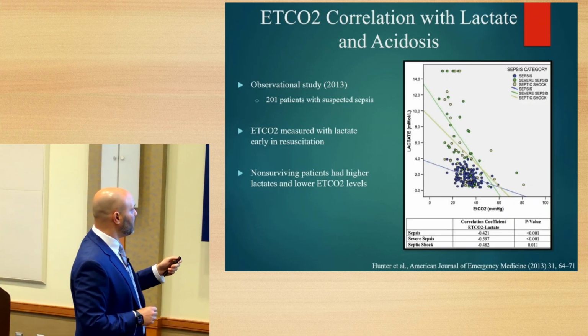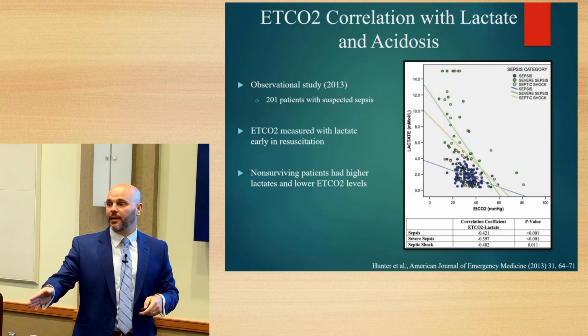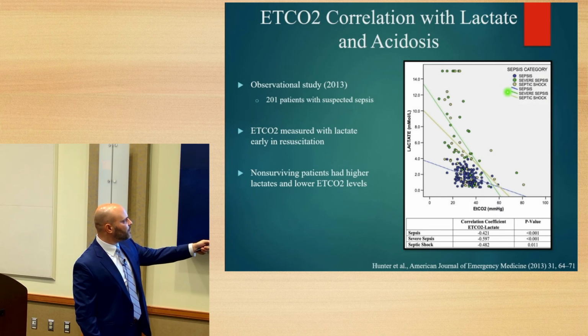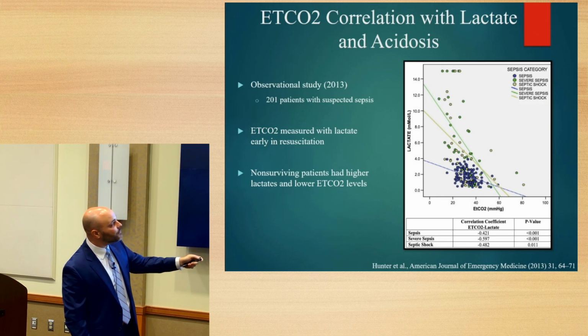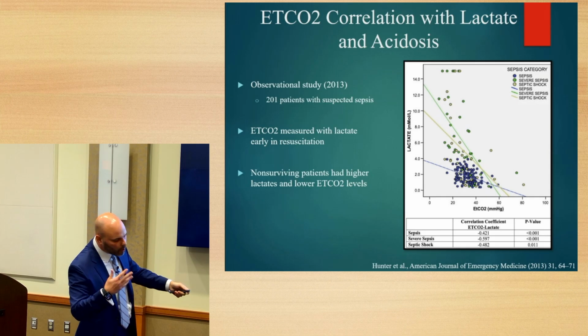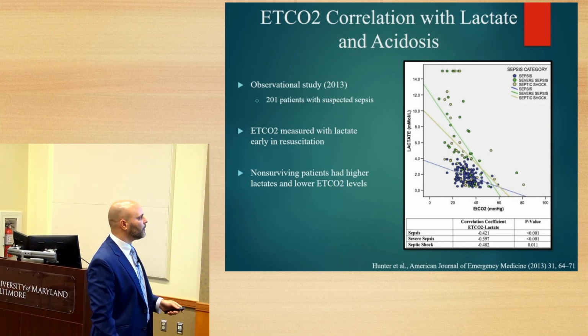And this is another study, again comparing end tidal CO2 while labs were being drawn in the emergency department in sepsis, severe sepsis, and septic shock. I want you to pay attention to the gold and green lines here, the trend lines. Pretty stark difference between low end tidal CO2 and higher lactates. So sicker patients correlated more with lower end tidal CO2s. Okay.